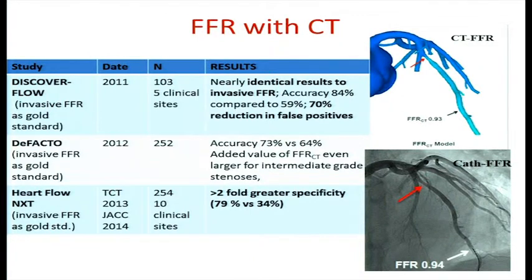So you can see the fractional flow reserve, which also has been talked about in many studies, and I'm sure Dr. Bera will also be alluding to them. So you can do this FFR by adding no contrast, radiation, cost or medication.